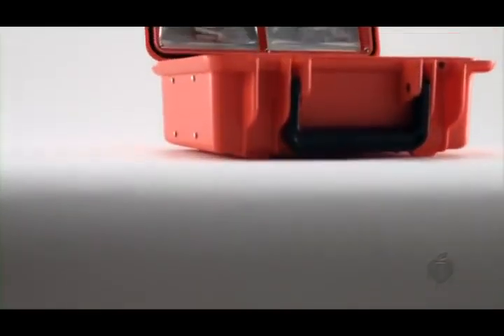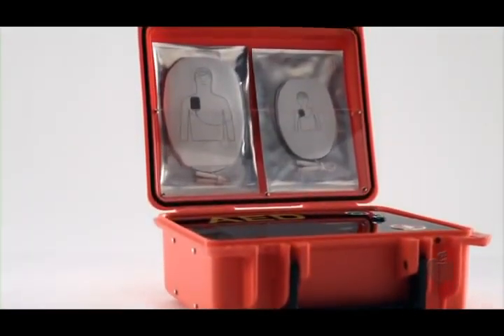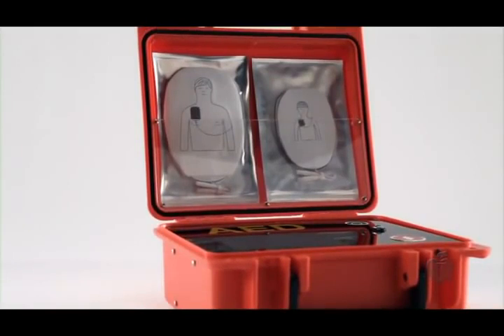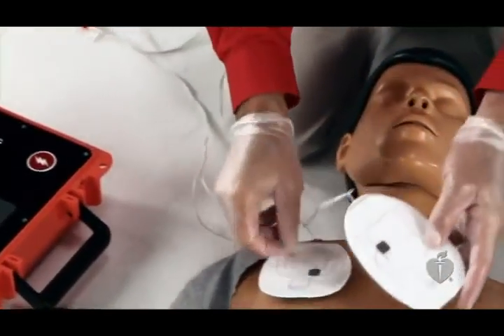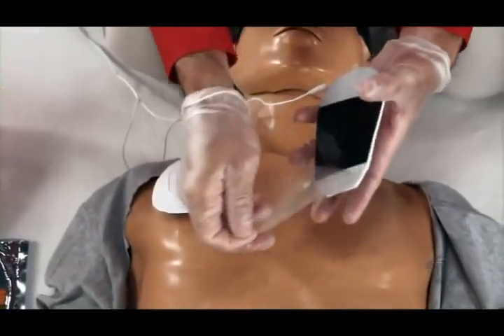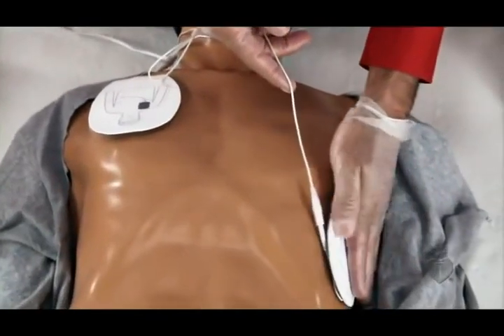Some AEDs may have adult and pediatric pads. Make sure you use the adult pads on anyone 8 years of age and older. Peel away the backing from the pads. Following the pictures found on the pads, attach the adhesive pads to the victim's bare chest.